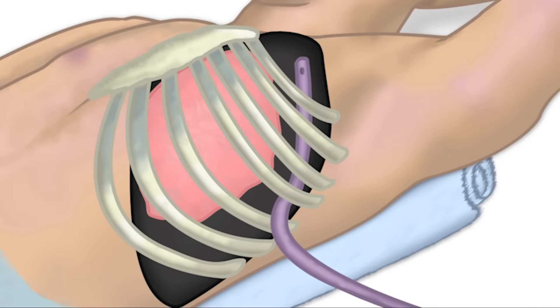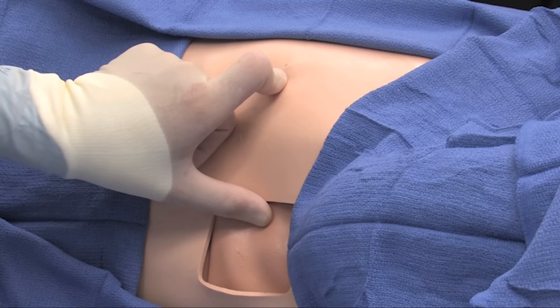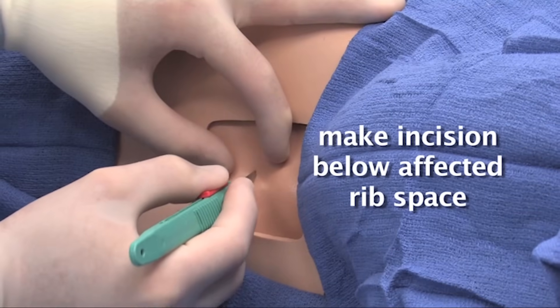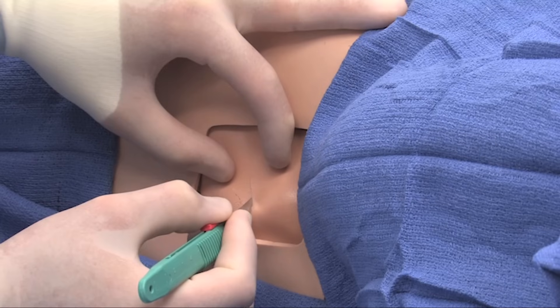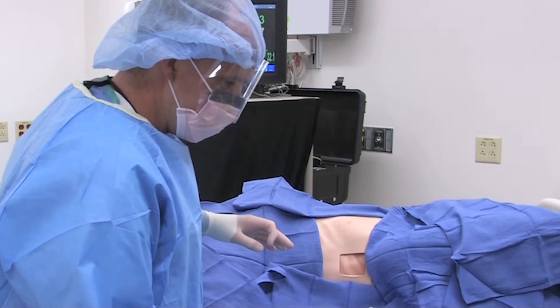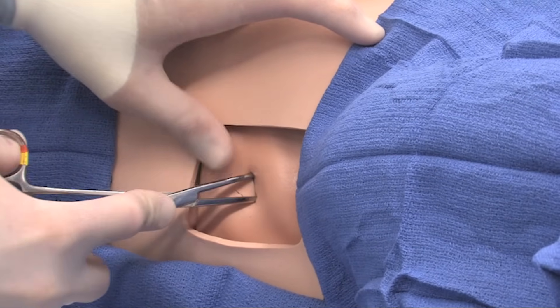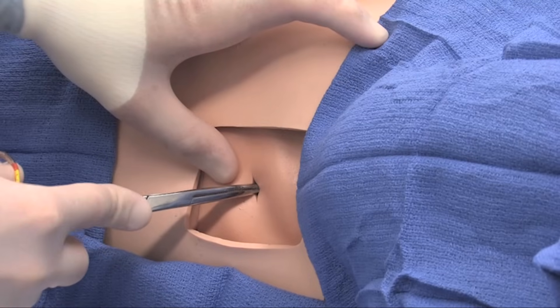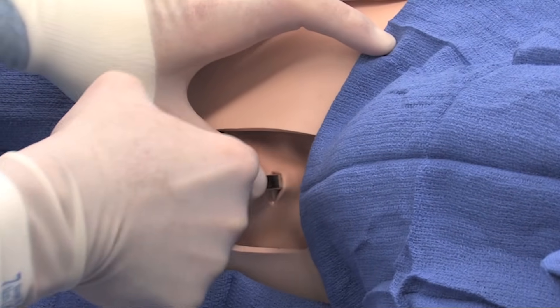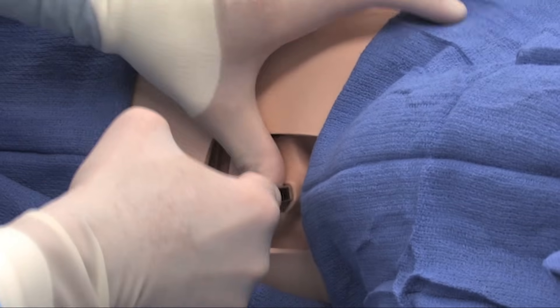Ideally, once the patient has been prepped, draped, and anesthetized, confirm placement. We document the nipple at the junction of the anterior axillary line on the affected side. We make an incision below the affected rib space, large enough to accept both the chest tube and the clamp for dissection. The incision is made with a sharp knife, which is then placed off the field to avoid inadvertent injury. With the blunt instrument, we find the affected rib space and gently dissect directly over the rib cephalad to confirm location, then dissect into the pleural space.